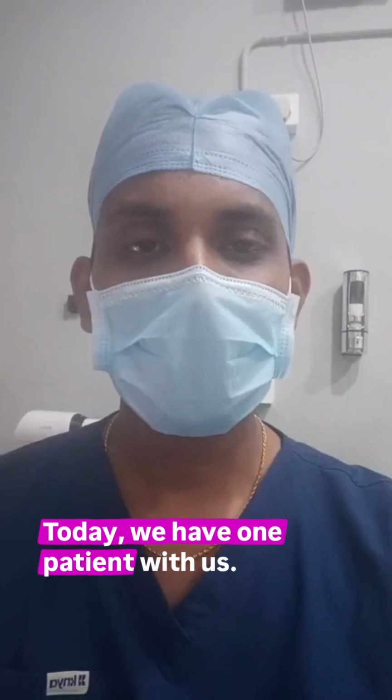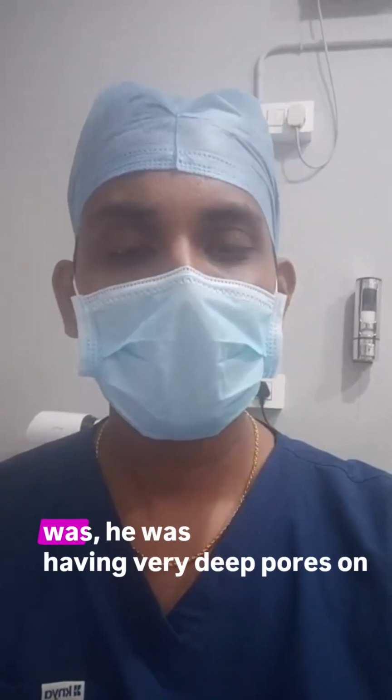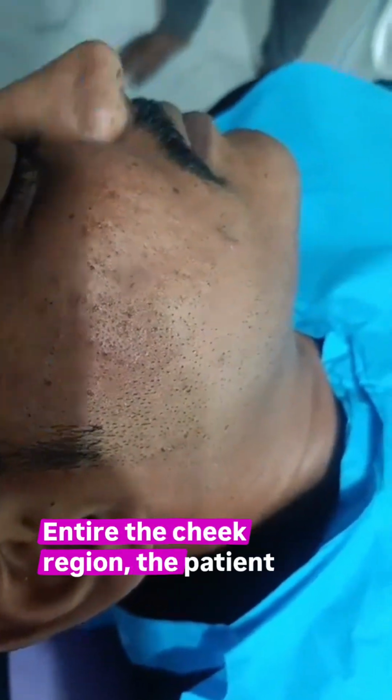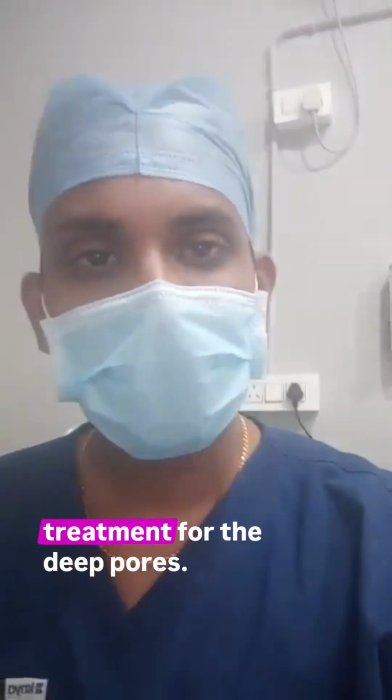Today we have one patient with us. The chief complaint for the patient was he was having very deep pores on the skin. Right now, here you can see. Let me turn the lighting. See, the patient's complaint was deep pores over the cheek regions. Can you see? The entire cheek region, the patient was having the deep pores. So the patient wanted to get treatment for the deep pores.